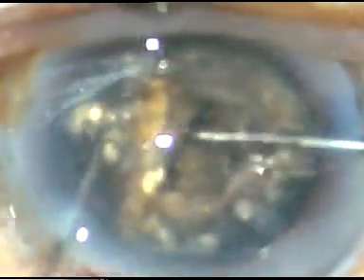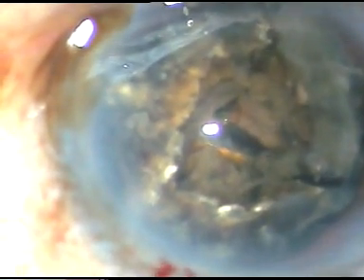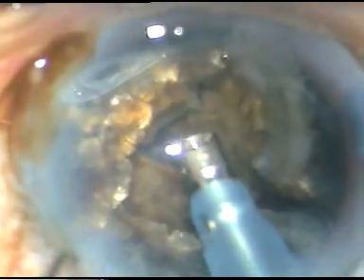And these other two parts — yes, that also. Now the nucleus has got three parts: one big hemi-nucleus, and the other hemi-nucleus has been divided into two parts. And now I am going into the eye again with the phaco handpiece. And this easy tip is marvelous — surprisingly, I don't get blockage of this tip. It never gets blocked, even with this hard cataract.